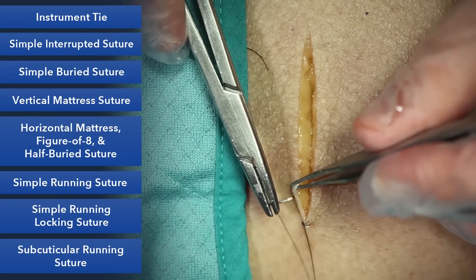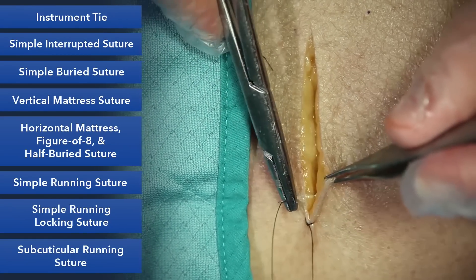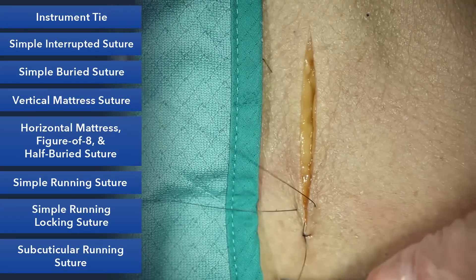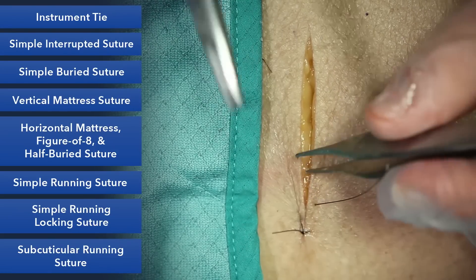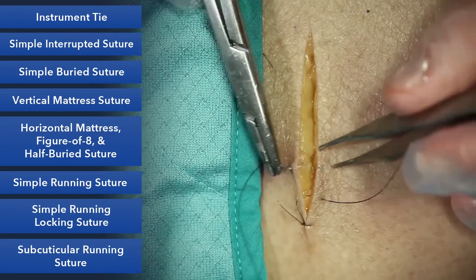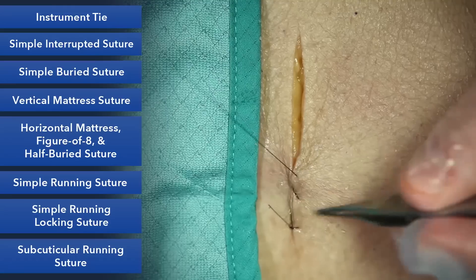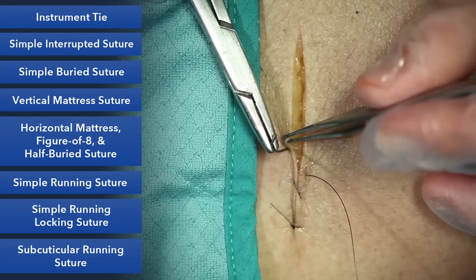You'll advance on the wound in symmetric fashion. Again, try to take 90-degree bites each time. Try to move along at the same pace and same amount each time, almost mimicking a sewing machine.